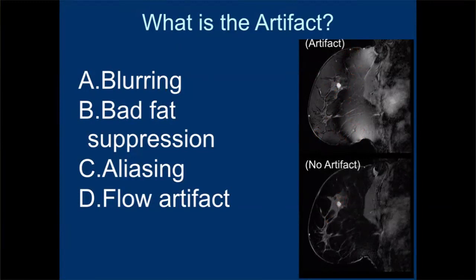All right, ready for the follow-up? I have a question. Yep. Why is it not a flow artifact? Like the white area in the middle. So this is not flow because first of all, there's not much flow here. Flow artifacts actually appear very differently. It could be that there are motion artifacts over here, but they appear in both images. So for example, this is a very blurred object. Anybody have an idea what that blurred object is?